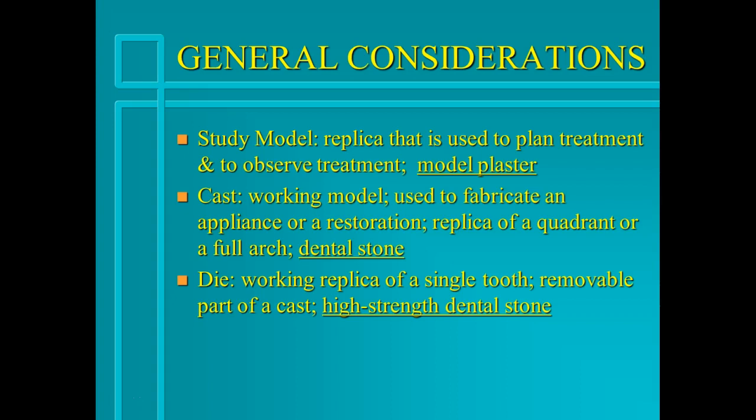When we discuss casts, a cast is a working model. It's used to fabricate an appliance or a restoration. It's either a replica of a quadrant or of a full arch. And the gypsum product that is normally used for a cast is dental stone.